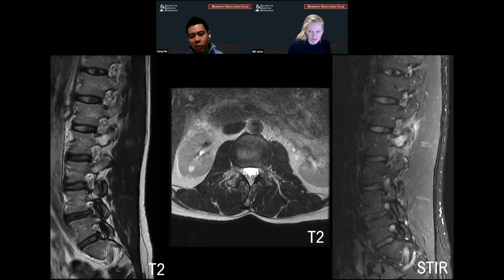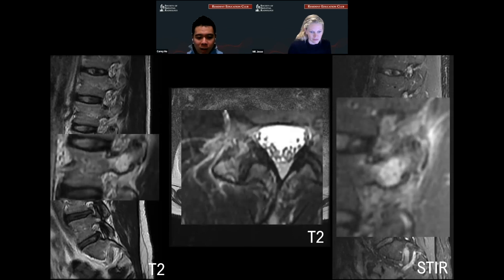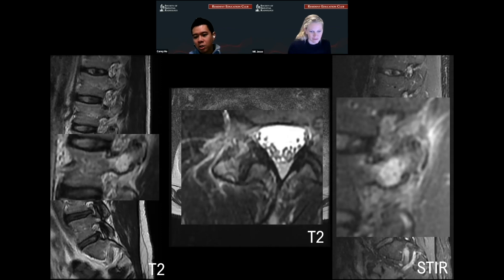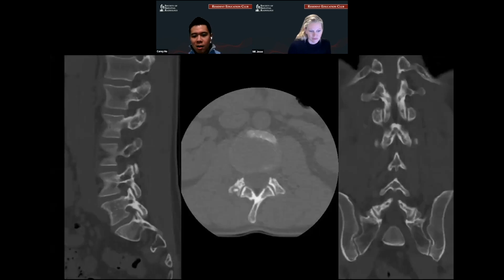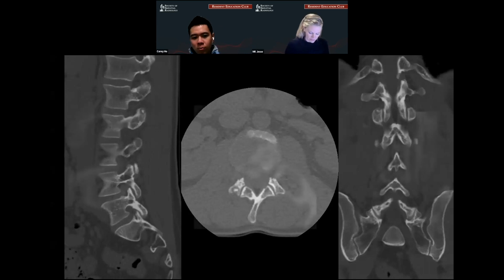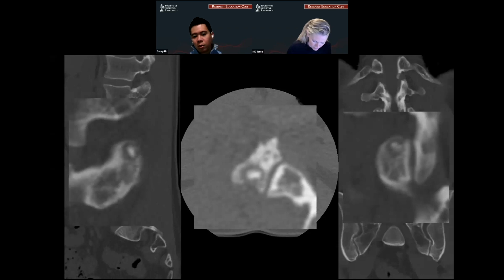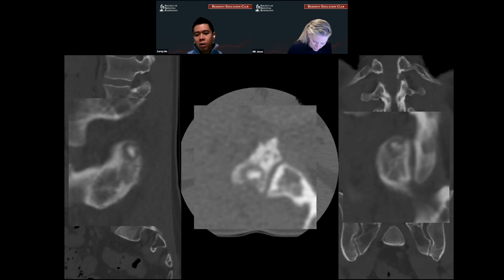This is the MRI. Within that posterior element of L2, there's signal abnormality that's hyperintense on the T2 images and also showing edema within the lesion and around the soft tissues on the STIR sagittal images. And on CT, looking in that region, I'll zoom it up for you — there's a dense nodule with some surrounding lucency that correlates to the lumbar MRI findings.